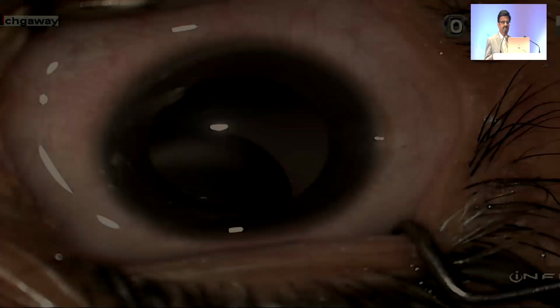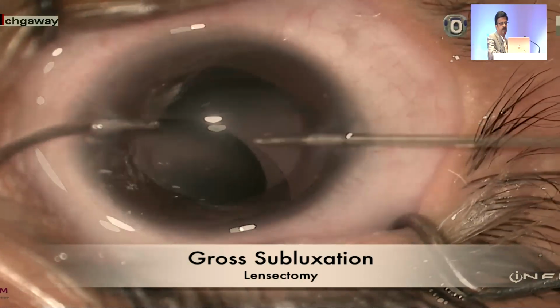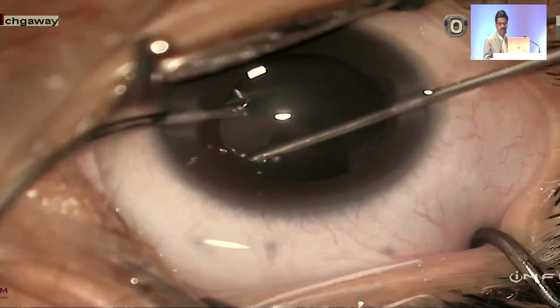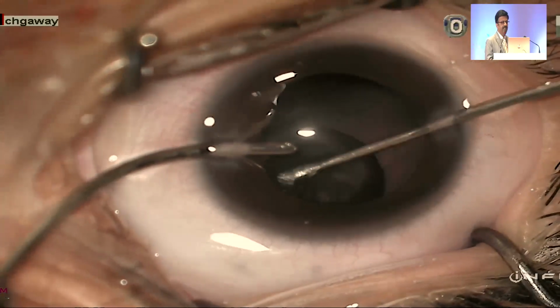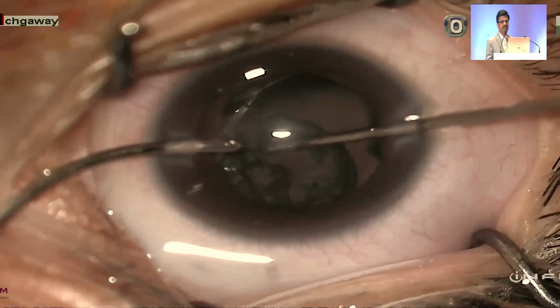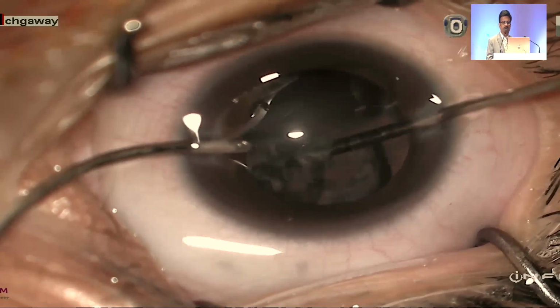Now this is what I have been leaning towards lately, because with all these capsular bag fixations, over a long period of time the lens starts giving way from the other side also. There is a lot of fibrosis, though almost all of them have been maintaining 6/9, 6/12 vision, but when you see it through the slit lamp, you always fear what would happen to this bag a few years down the line.